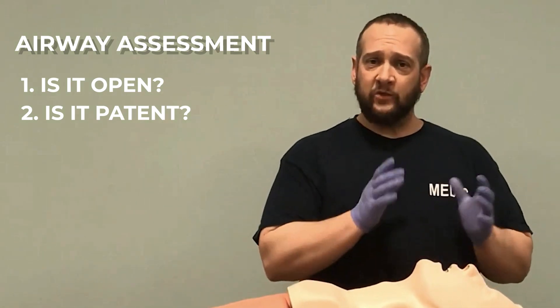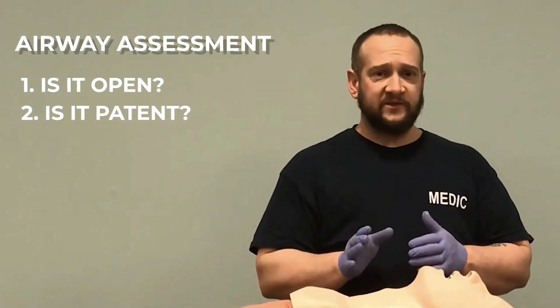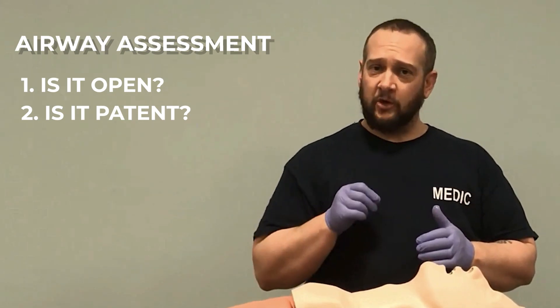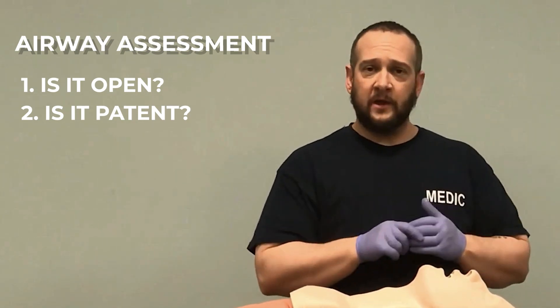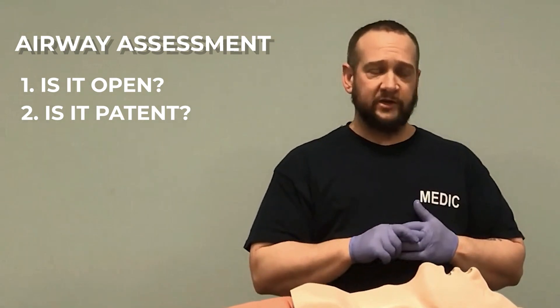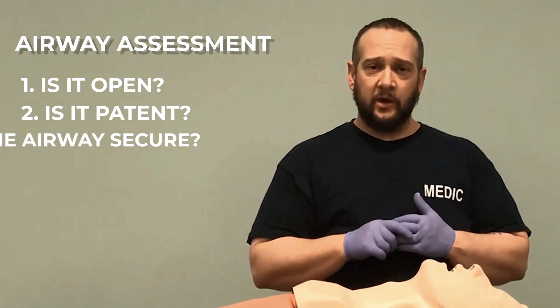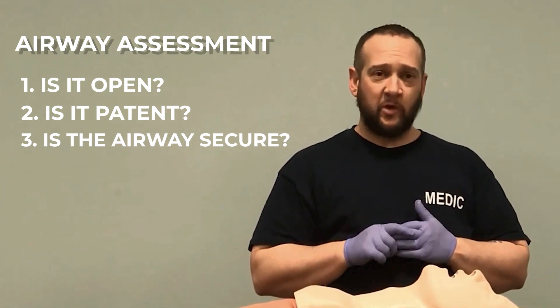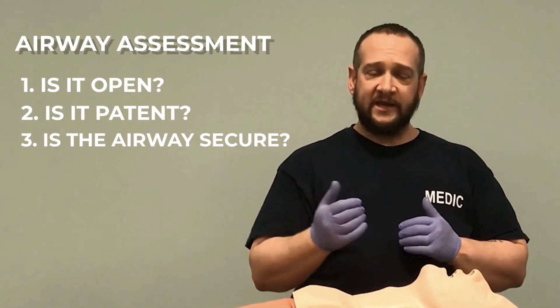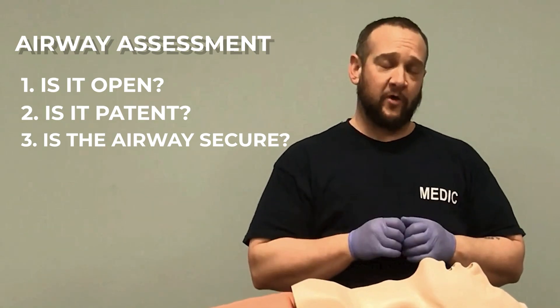We always want to use a systematic approach. Suction for no more than 10 to 15 seconds, not losing sight of the distal tip, suctioning on the way out. Then place the catheter in sterile saline so it can be reused if needed. Third: is the airway secure? If the patient is unresponsive, the answer is always no — so we need to intervene to prevent the tongue from falling back.